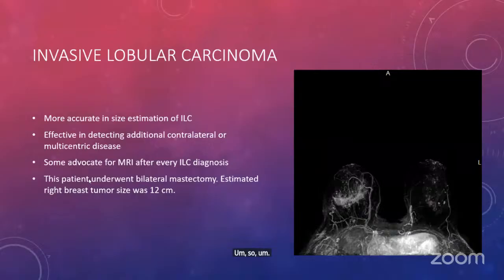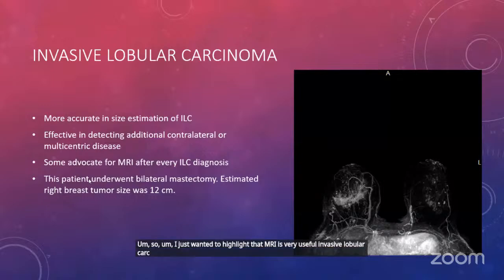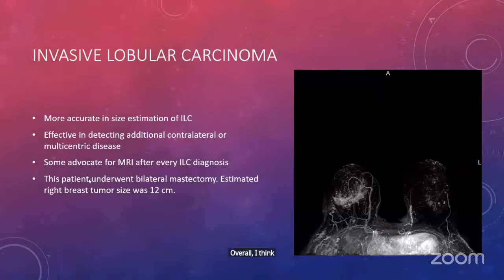I just wanted to highlight that MRI is very useful in invasive lobular carcinoma, and it's most accurate in size estimation of ILC. There's some literature that says that maybe we overestimate with ILC, but overall, I think many people feel that MRI is best in this situation.